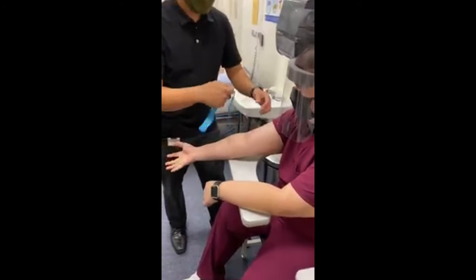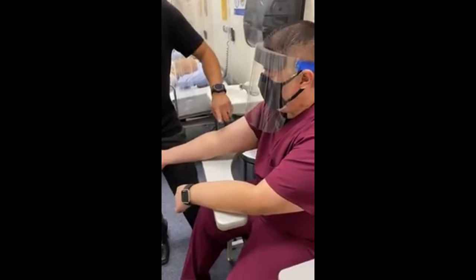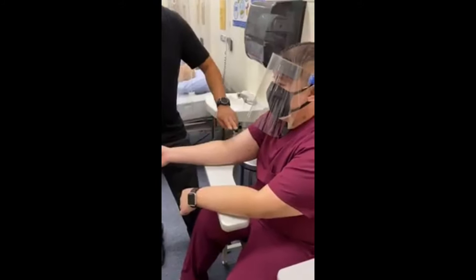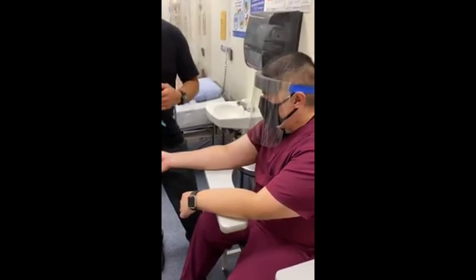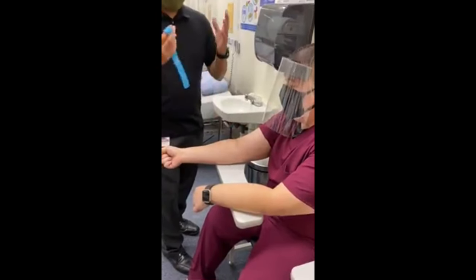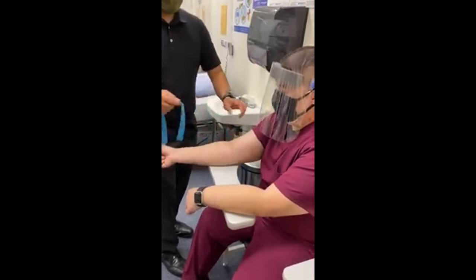So when you're looking for the vein, you can feel for the vein with your gloves, but since you guys are just starting out, I made the list where you can feel for the vein first, and then once you find your vein, before you clean the site, that's when you put on your gloves. Hand sanitize again, or you don't have to hand sanitize again, as long as you put on your gloves and then clean the site. Then when you put the tourniquet on the second time, you already have gloves on.